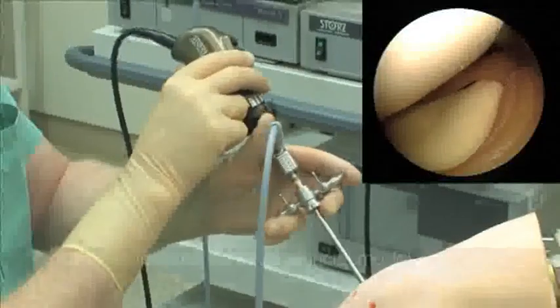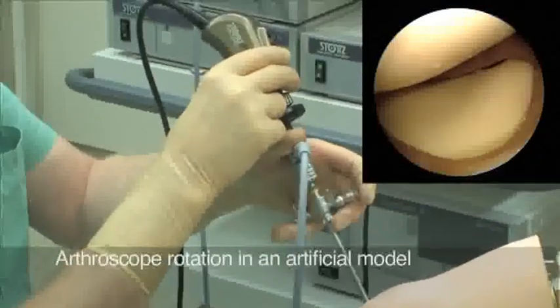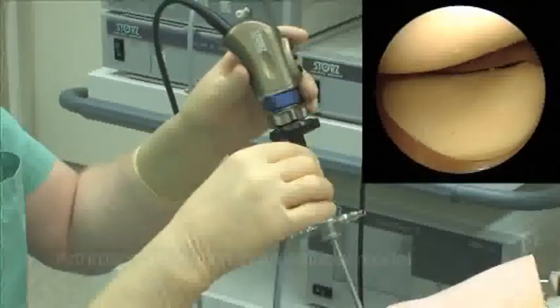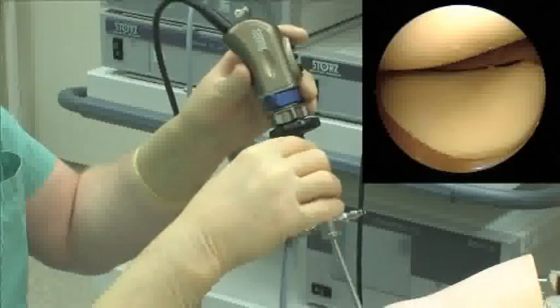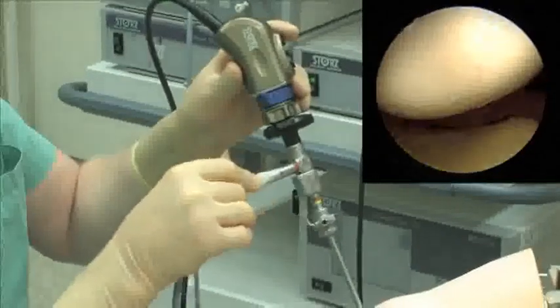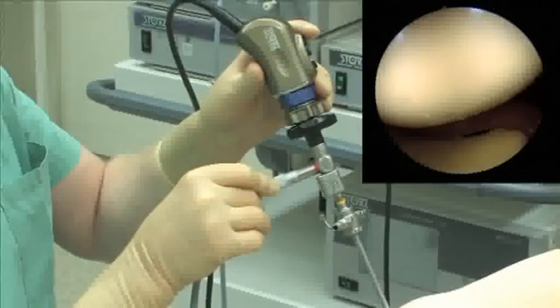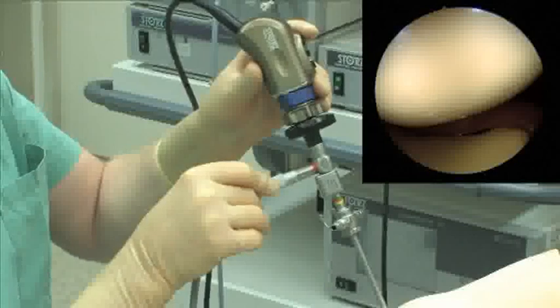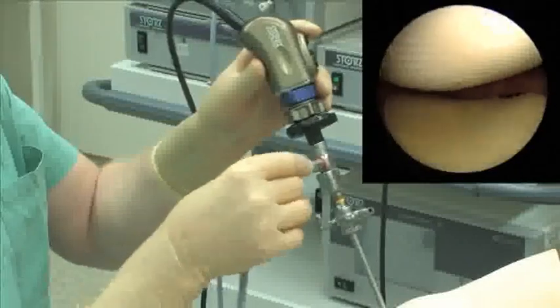We are now turning the endoscope toward the lateral joint compartment and are visualizing the lateral meniscus. The light cable is in a 3 o'clock position. By positioning the light cable at 6 o'clock, we have a direct view of the cartilage of the lateral femoral condyle, but have no field of view of the lateral meniscus.